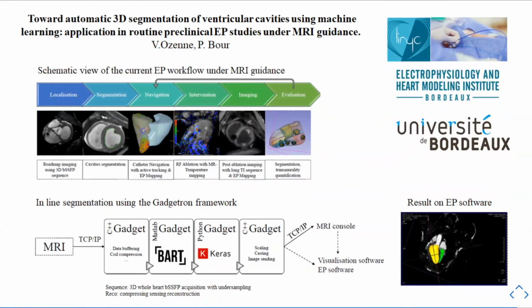And finally, Valerie, who we just heard speak, has been developing an application where he's using all of this. So he has a chain that starts out with a couple of C++ gadgets for doing the pre-processing.